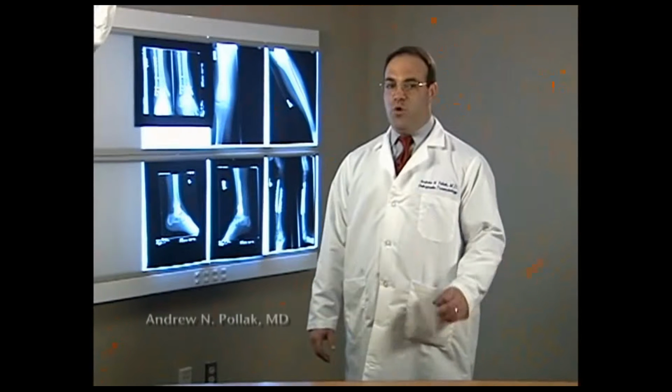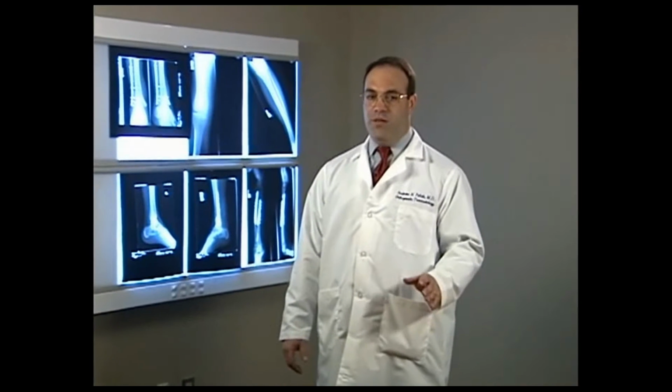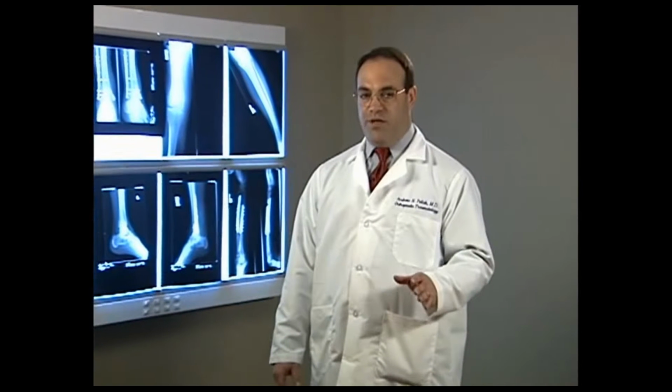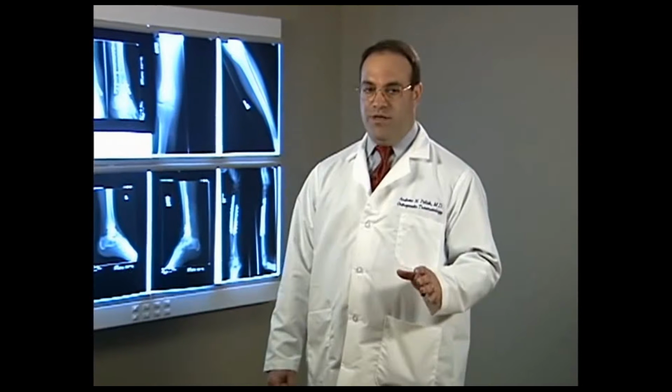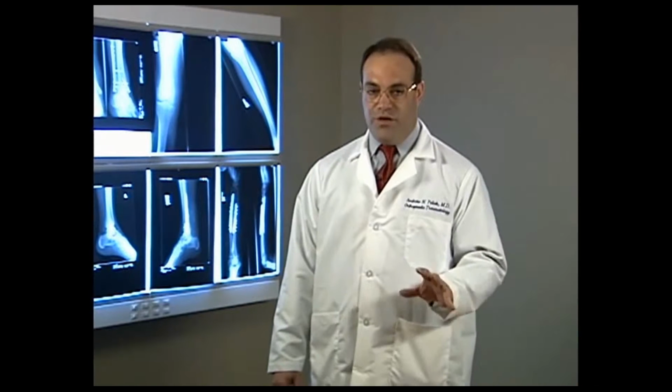It takes more than one person to properly manage a femur fracture. This skill is not needed frequently, but when it is needed, it requires a coordinated effort to stabilize the leg, apply traction, and secure the splint. Constantly talk with your partner so that there are no surprise moves that could injure the patient.